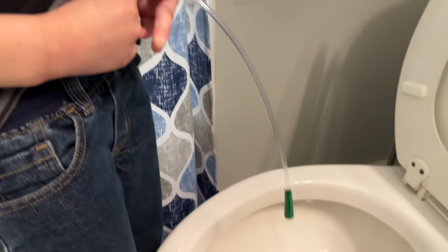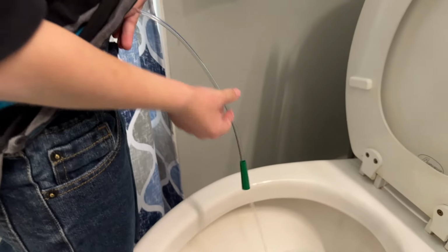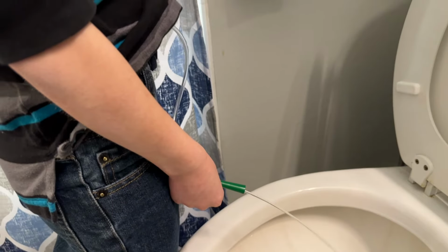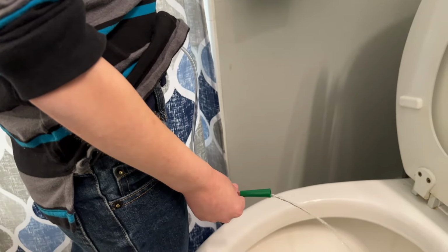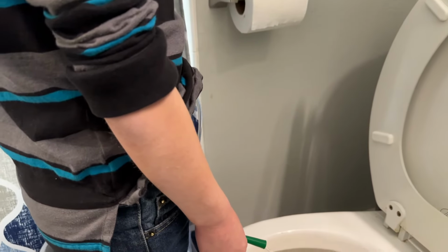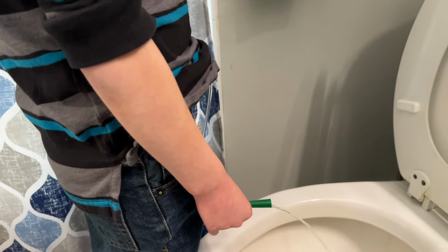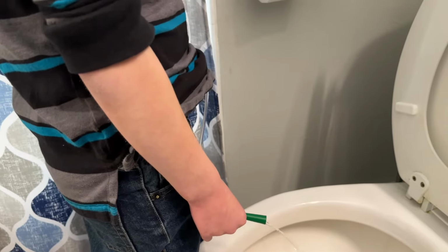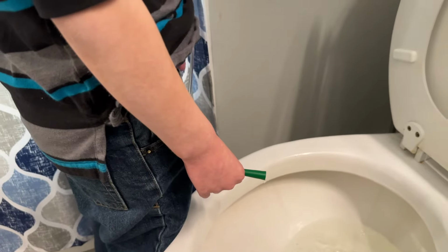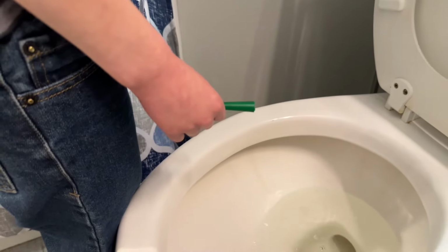Nice and slow, so you don't poke a hole in your stoma. That's right. Out it comes. There is such a thing as, especially with teenagers, they get in a hurry and want to pee fast, and they jam the catheter in super fast. If they do it too fast, they can kind of poke a hole-ish in their stoma, and it's called a false pass. And that requires a few weeks to a month to heal up. So we always want to be gentle and slow whenever we're putting a catheter in, but usually we don't have any issues with it.